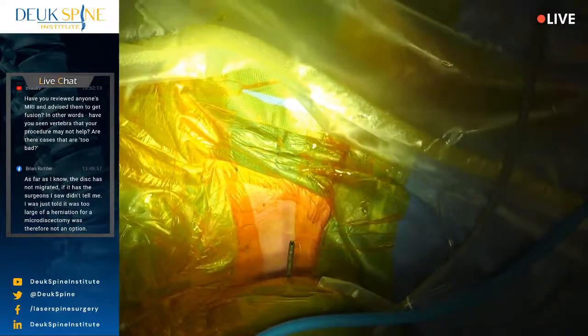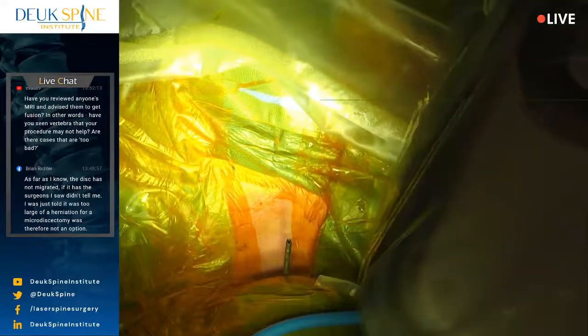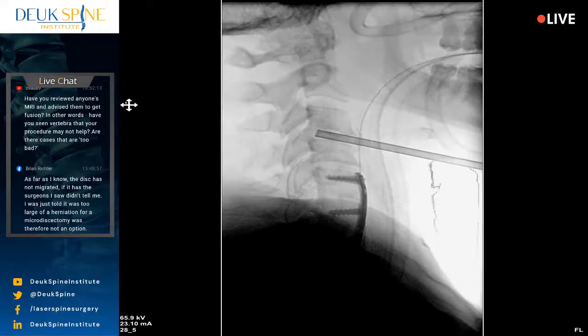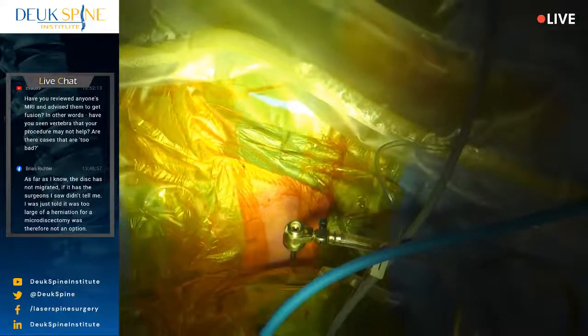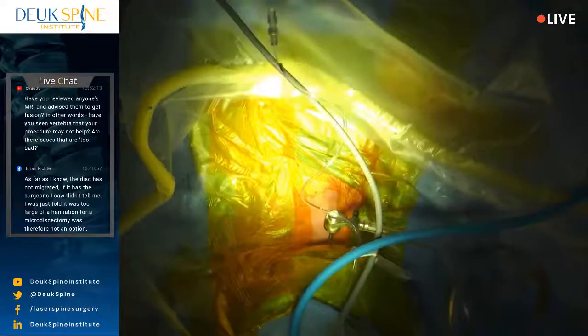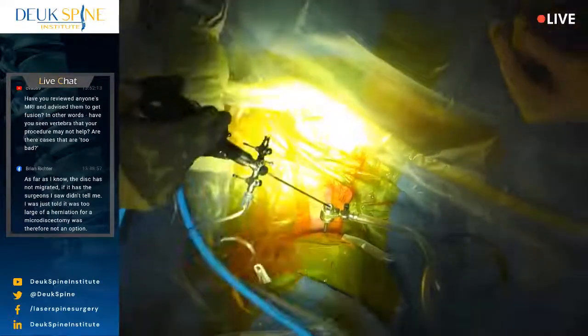We're going to go to the back of this C3-4. Now I've done two C3-4 discs. C3-4 herniations are not common. They're rare. We don't see a lot of them. I mean, they're not common that they cause symptoms. But in this patient and the one I did on Tuesday from San Francisco, they do cause symptoms. So for this week, C3-4 is common, but normally you don't see C3-4 disc herniations that need surgery.